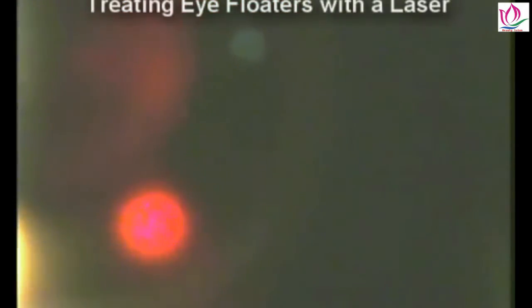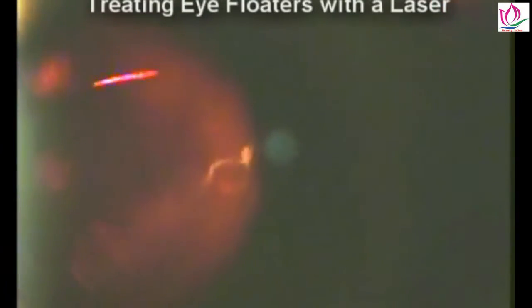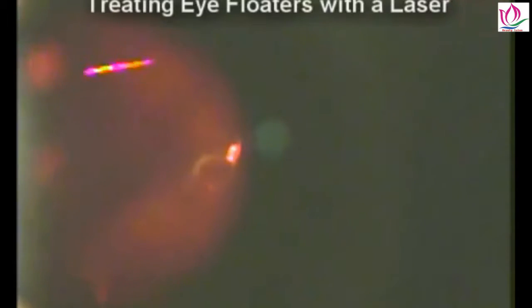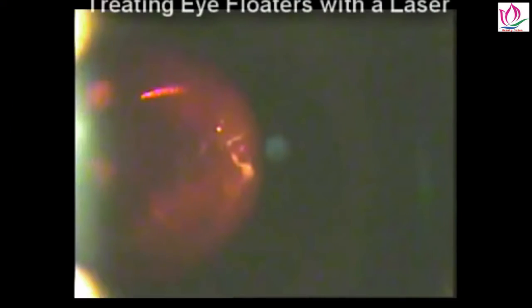So the treatment strategy is to try to get everything lined up just right, optimizing the laser energy. I have my two red focusing beams, and when I get those two perfectly lined up right on the surface of that floater, I'll activate the laser. There we go. And there's a freeze frame. And in doing so, I have broken part of that ring.